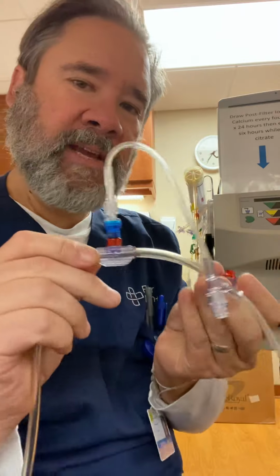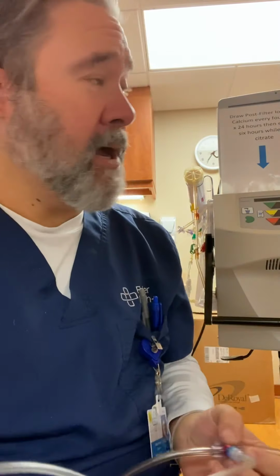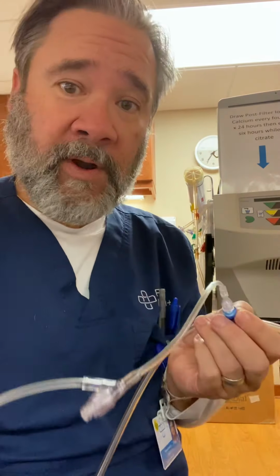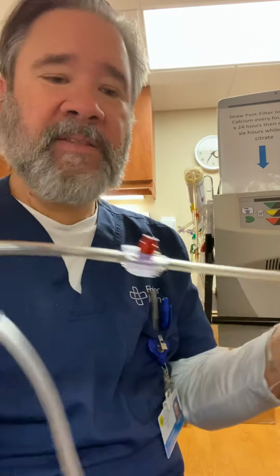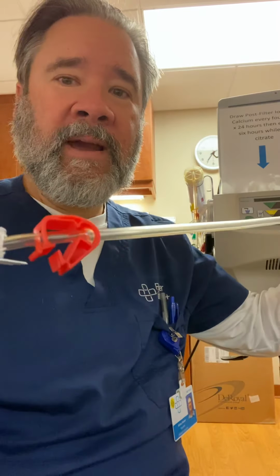But if we use the anti-reflux valve and put that in, this will be able to go at our normal rate. Our starting rate for citrate is 125 an hour, and that will be no problem if you've got the anti-reflux valve. You'll see that I've got this put in the way down here.